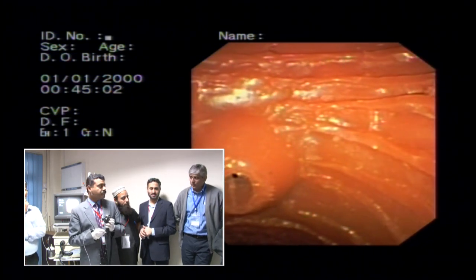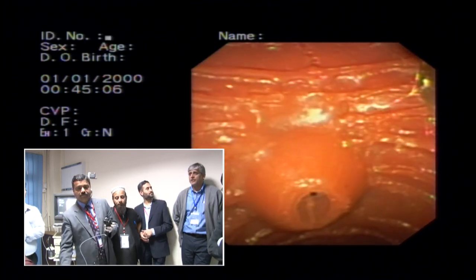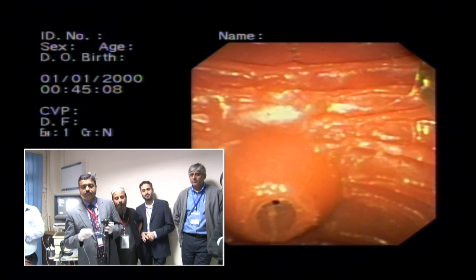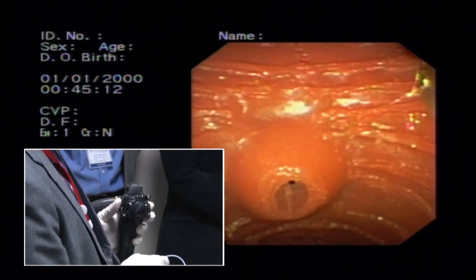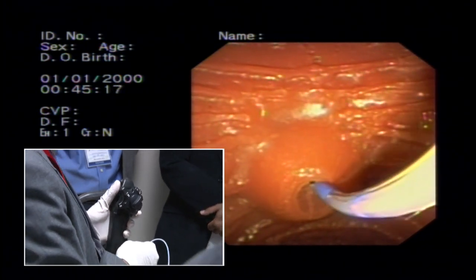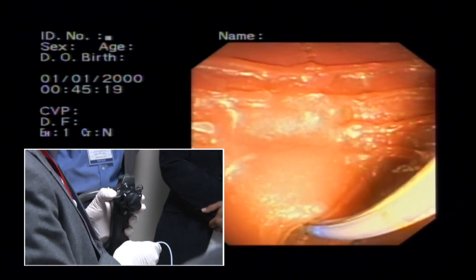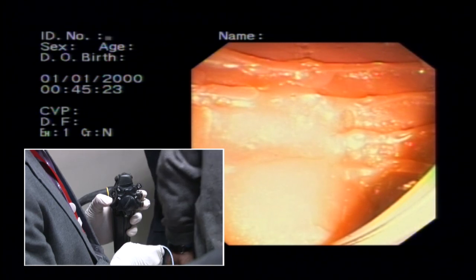Most of the time what we are emphasizing on is the common practice. What would cover up your 80% cases. 80% of your cases, these movements are all you need. These are the movements that you need. Even if it's ampulla, whatever is present. Ampullary carcinoma, what's going to happen? This ampulla will change into a big balloon thing.